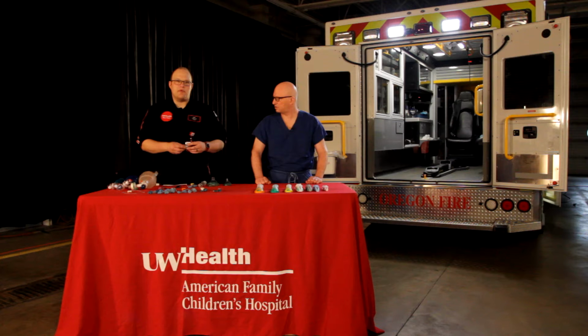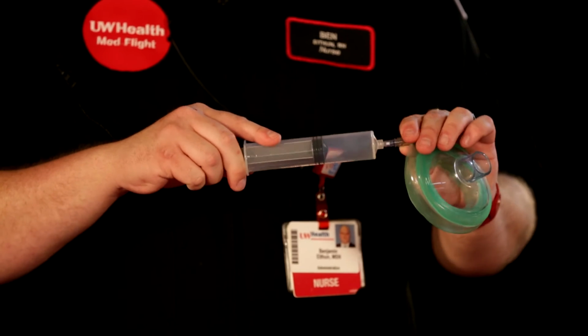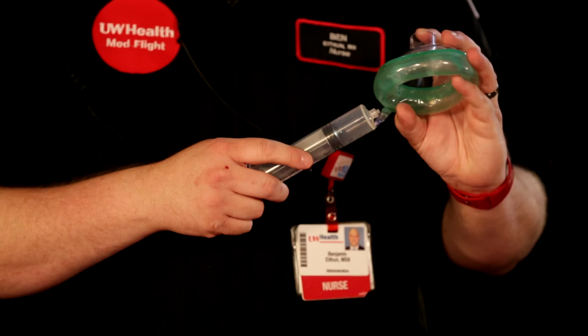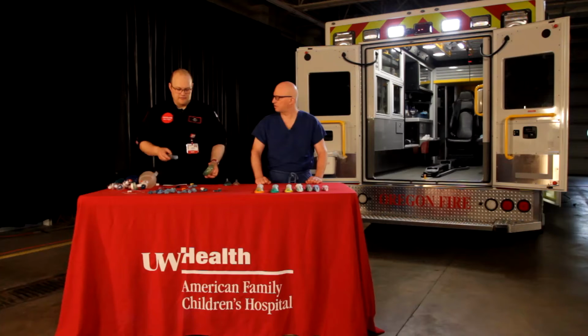The one thing also to remember with peds is that because of their size variation, sometimes you need to do adjustments. Most of the bag masks that I use have these ports where you can actually add some more air into the mask, so that if you're not getting a great seal, you can make some adjustments. So anytime you do a bag mask ventilation, just make sure you have a syringe so that you can either decrease or increase the amount of air within the bag.